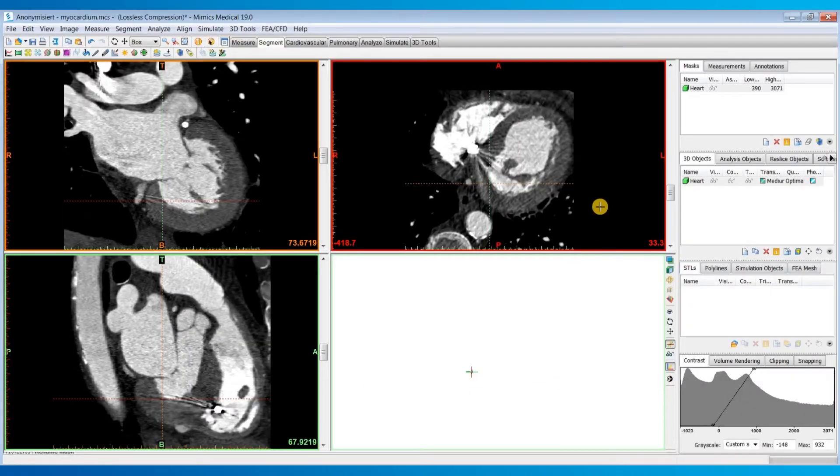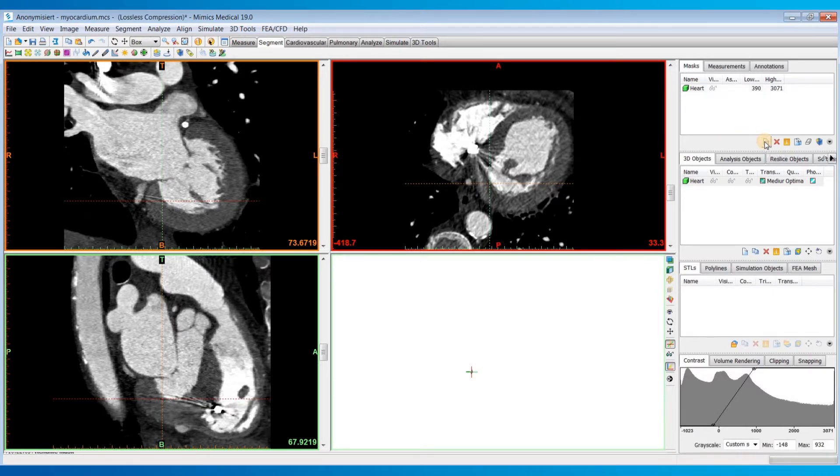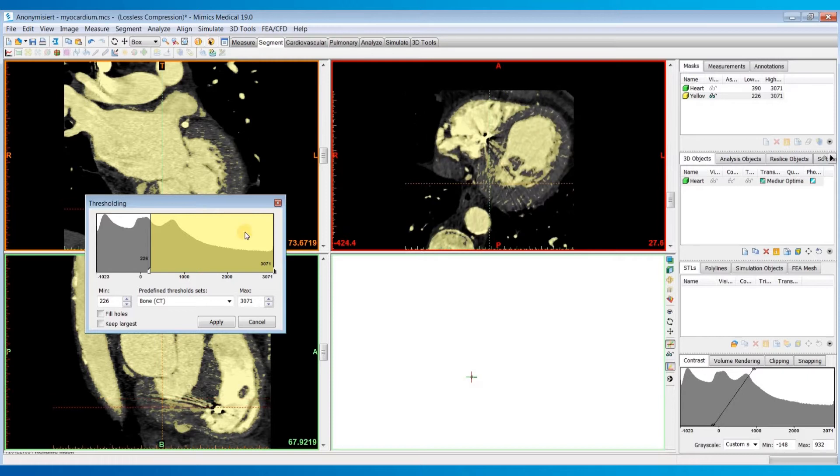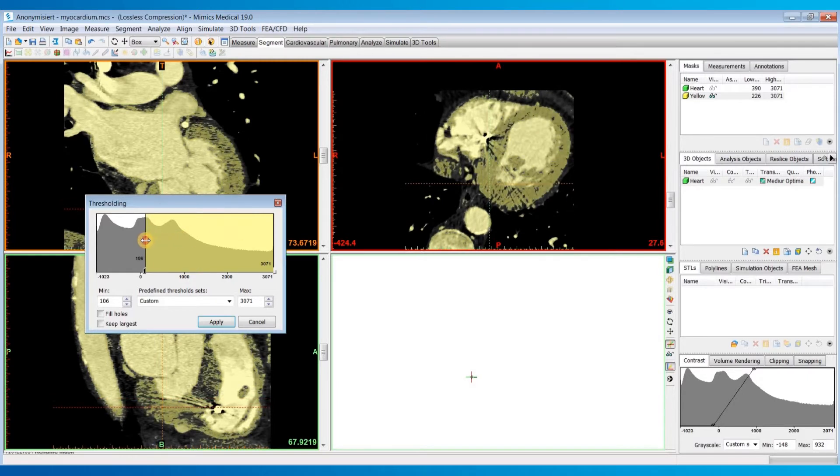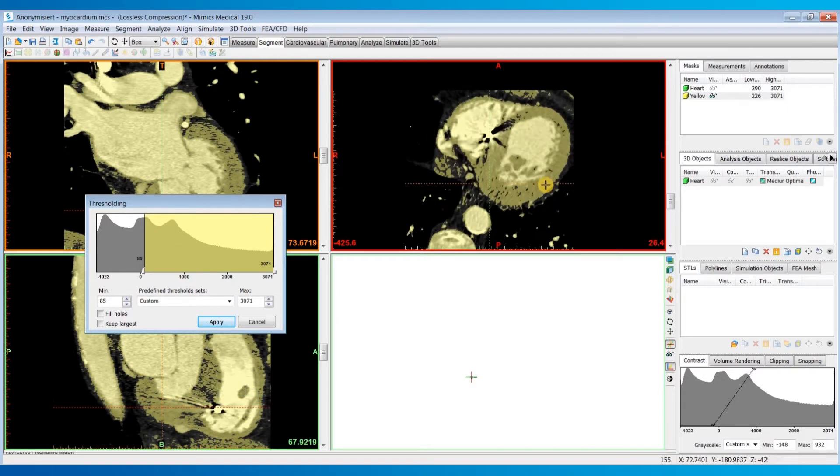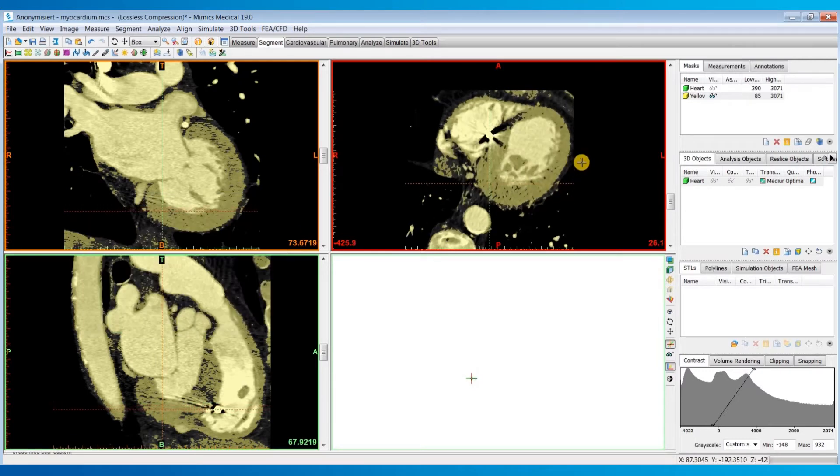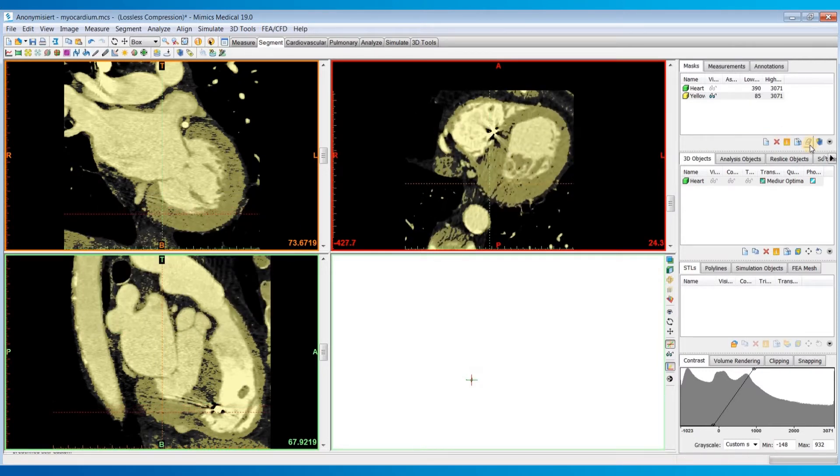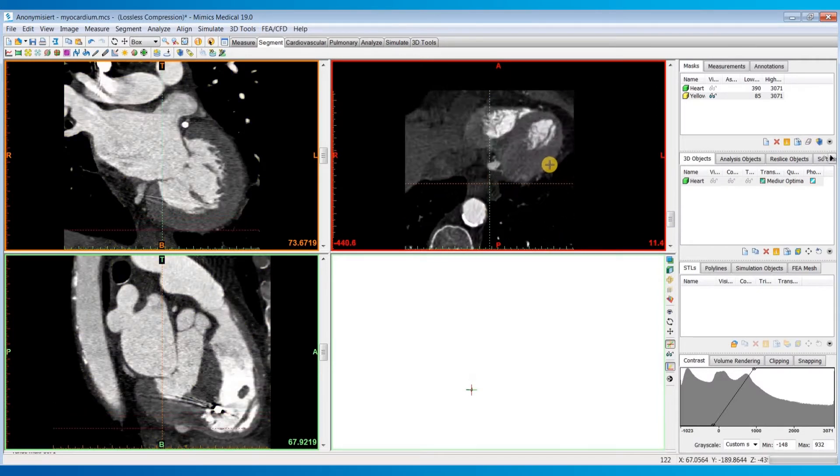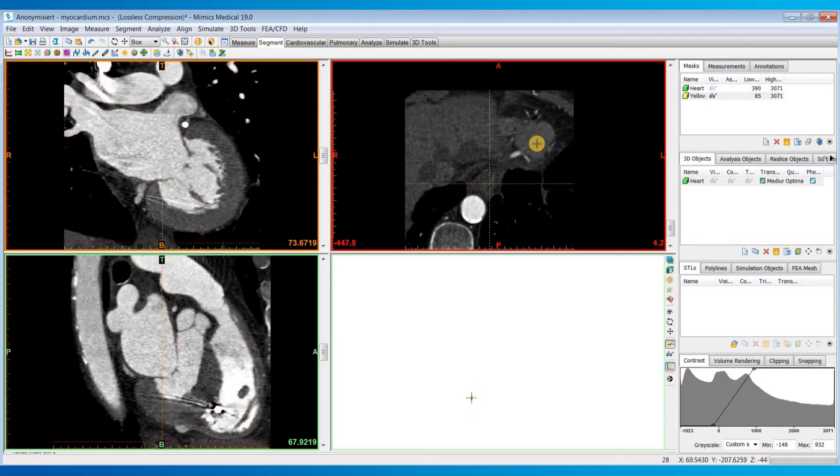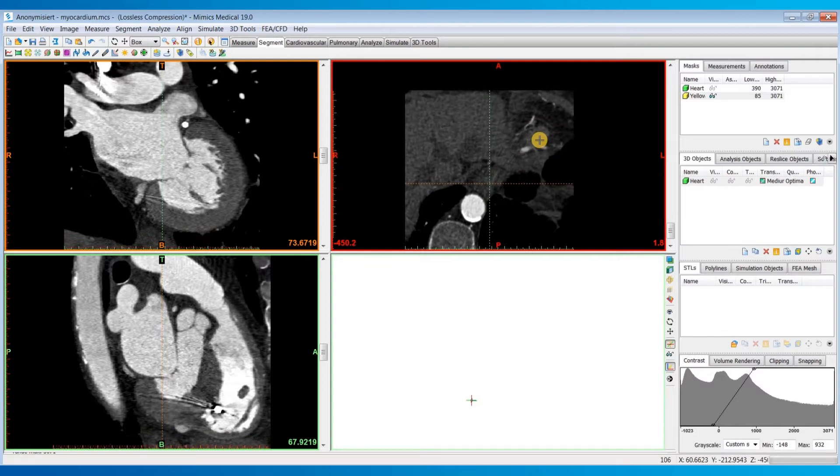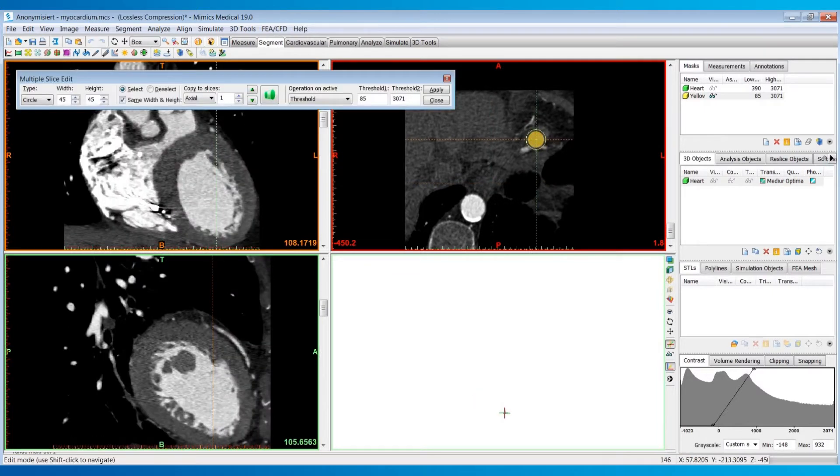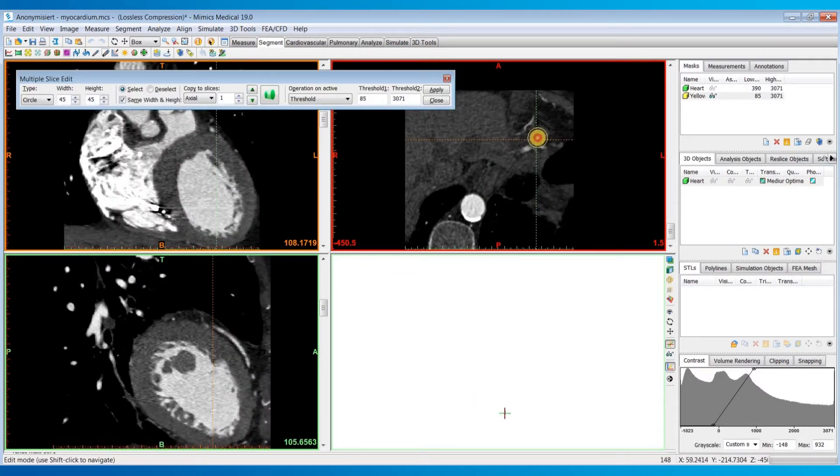Starting with the segmentation of the myocardium, I'll click on the new mask button here and choose a threshold range that accurately captures the myocardium, then hit apply. I'm going to hit this eraser icon to clear the mask because we'll then use the multi-slice edit tool to manually select the region of the myocardium and do a local threshold on this region.